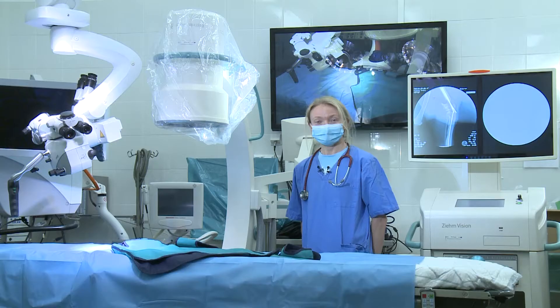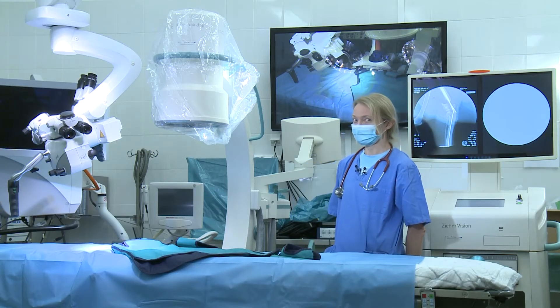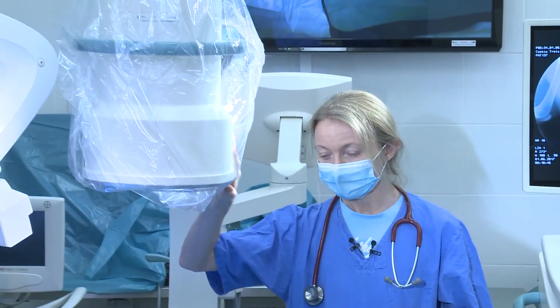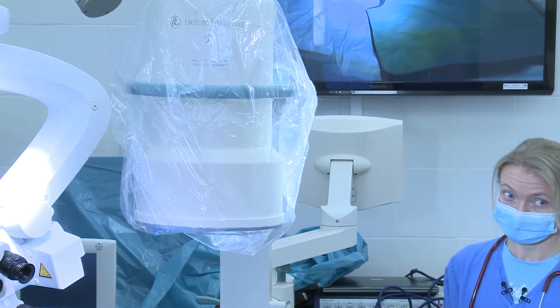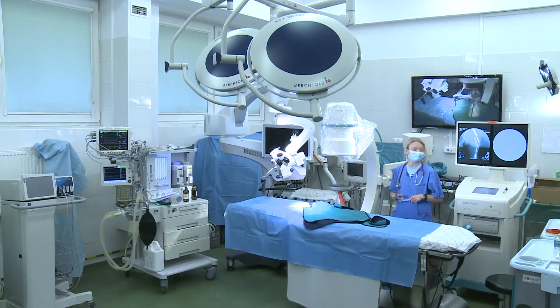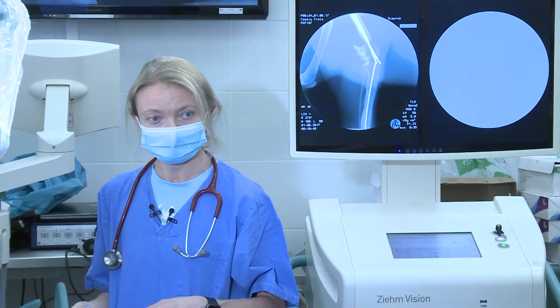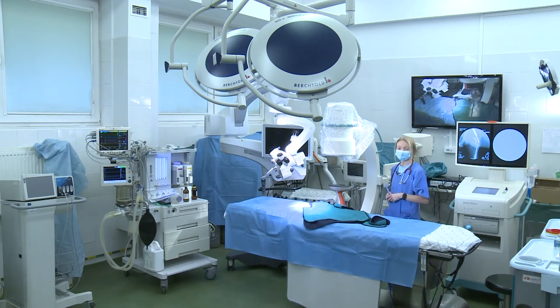Hello everyone! Today I would like to tell you something about this mysterious device which allows us to see what is inside our patients — not only in a stationary way, but also as a dynamic process during each kind of surgery which we will proceed.